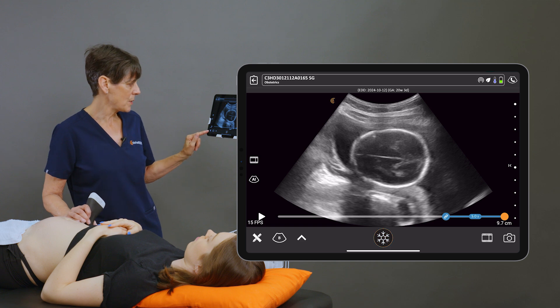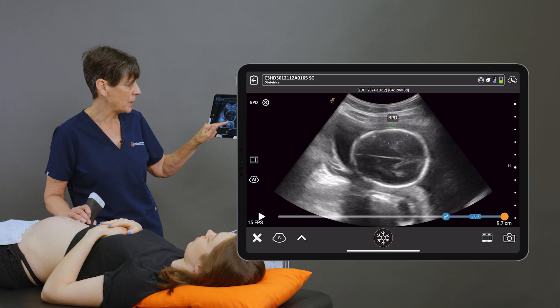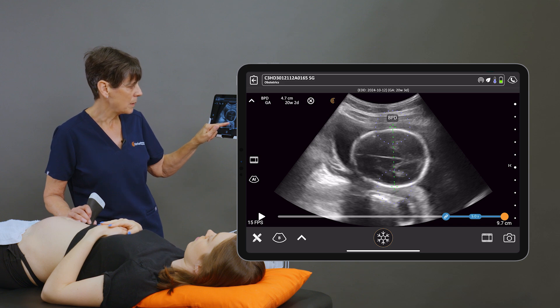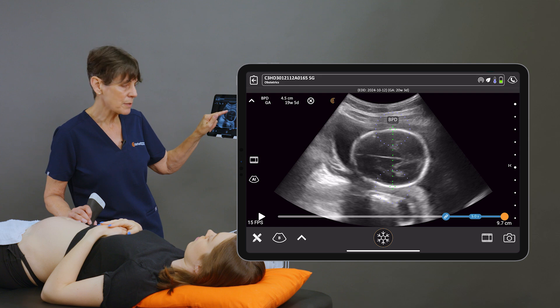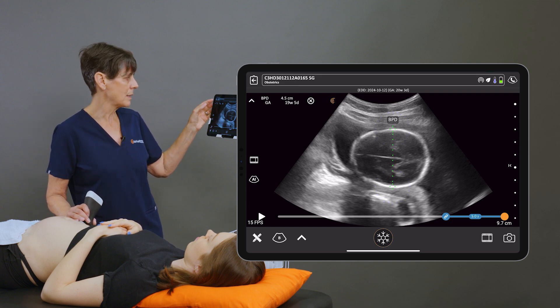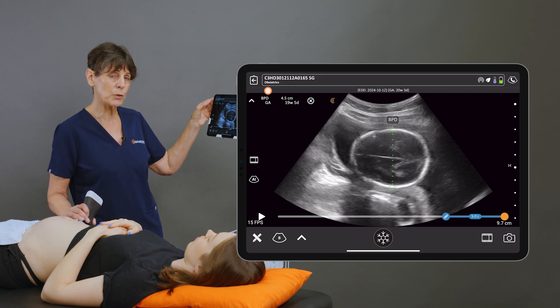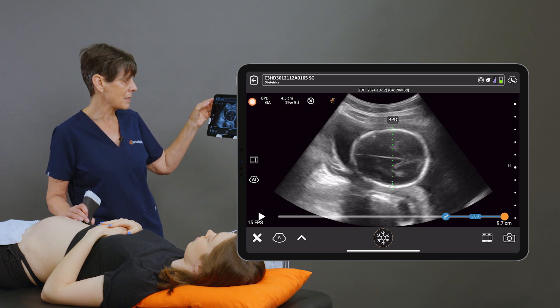I'm going to freeze my image, go into the tools menu and select the BPD. I'll place my calipers and make adjustments from the outer skull to the inner skull, and that's giving us a measurement of four and a half centimeters, which corresponds to 19 weeks and five days.